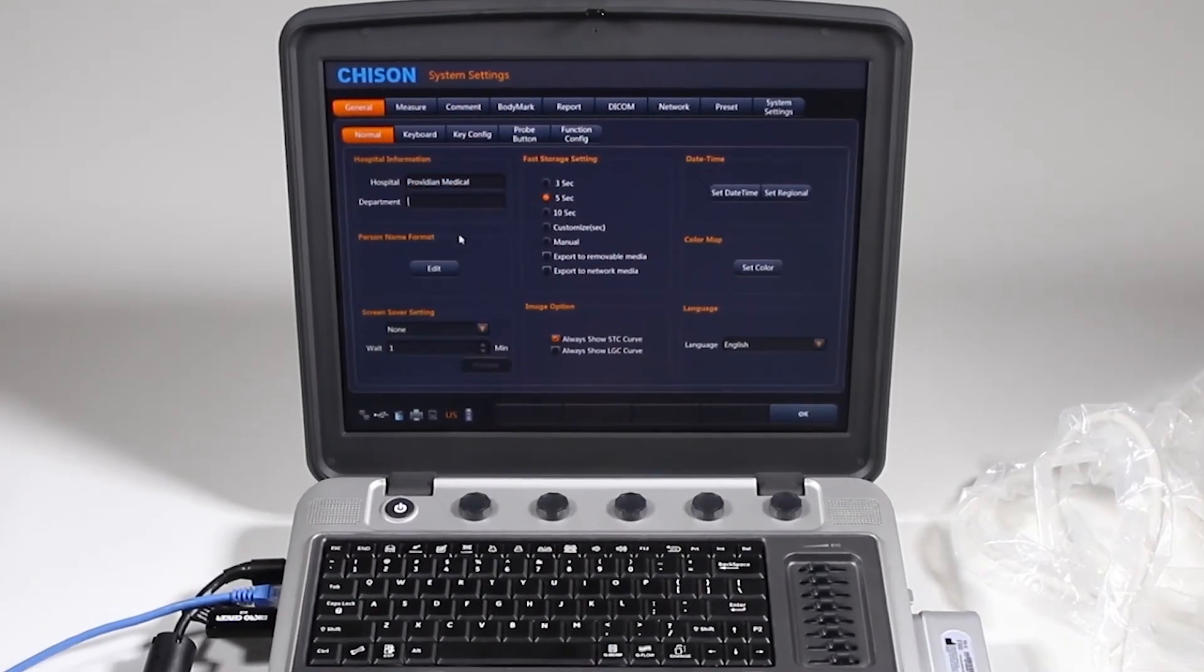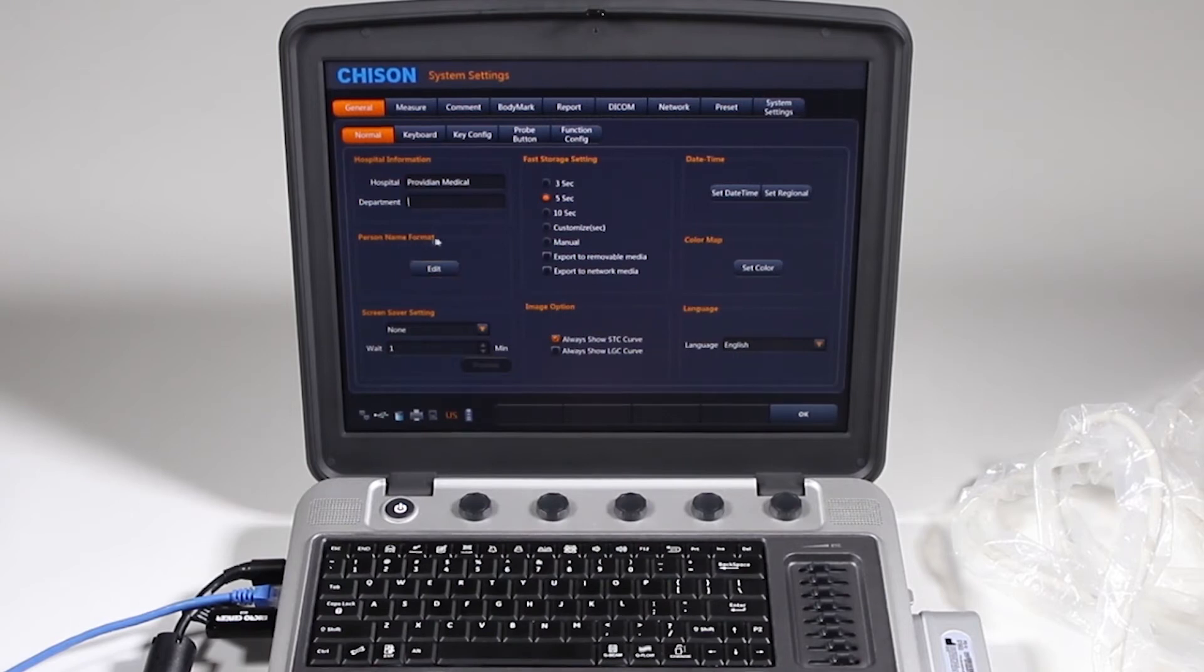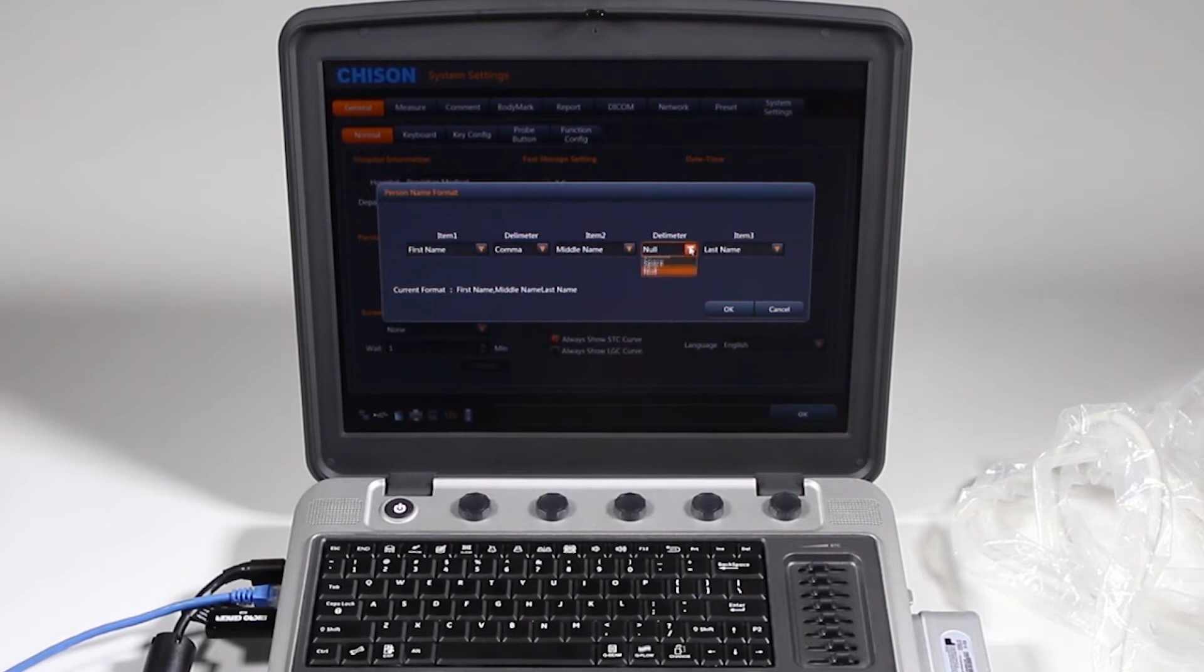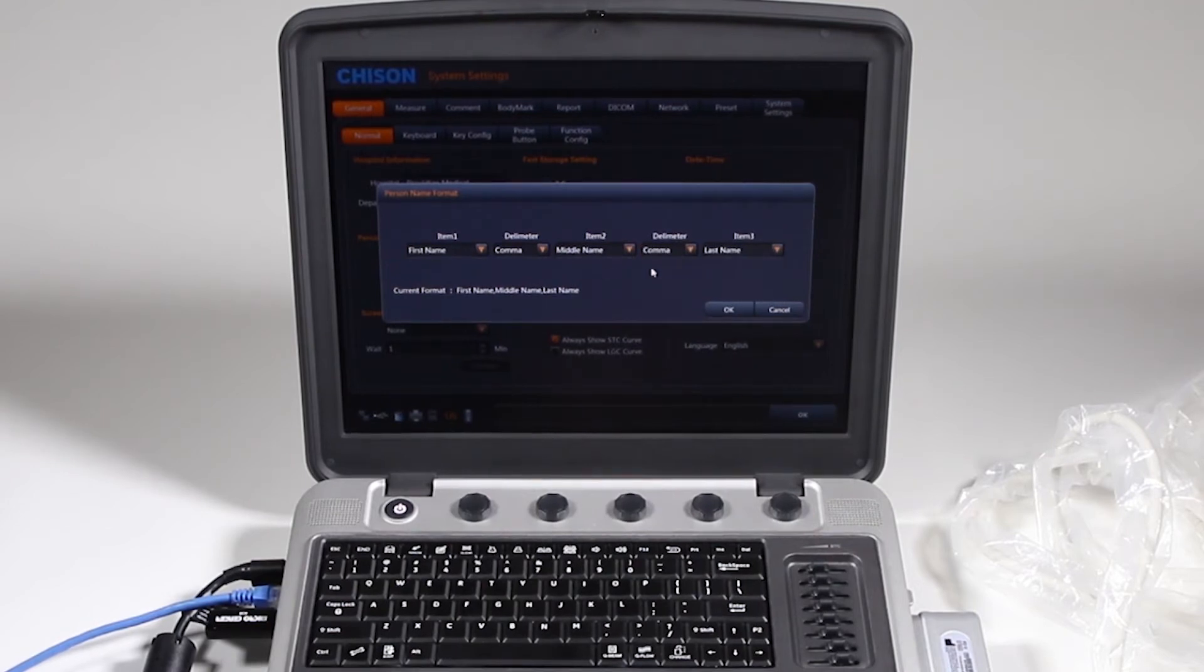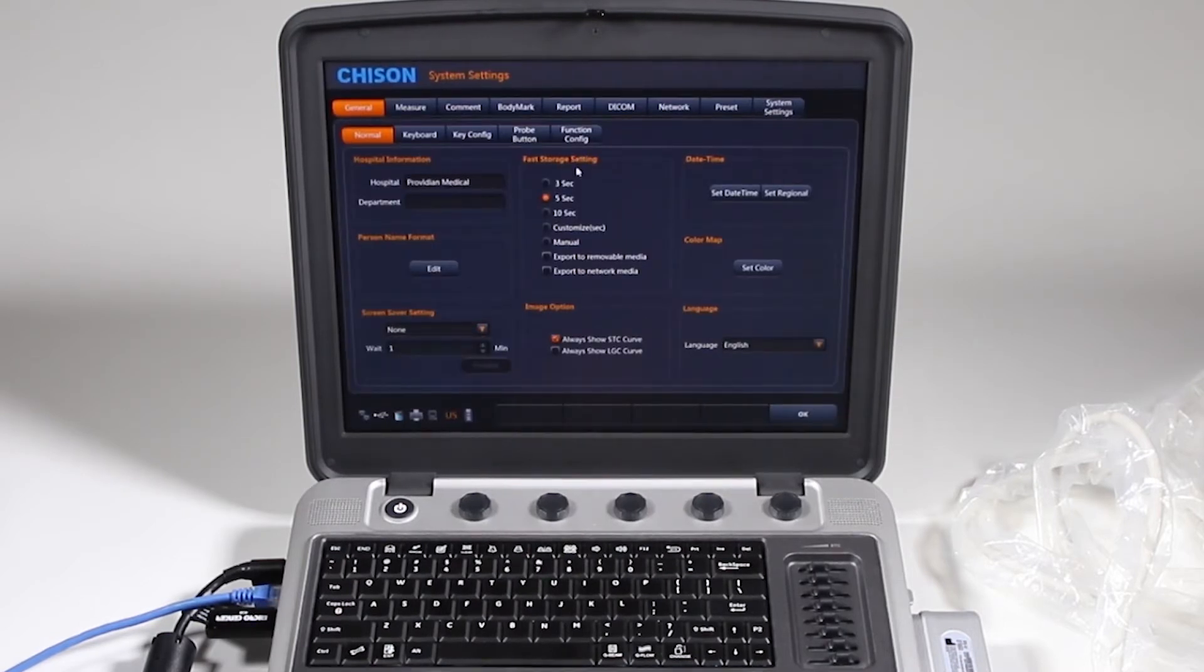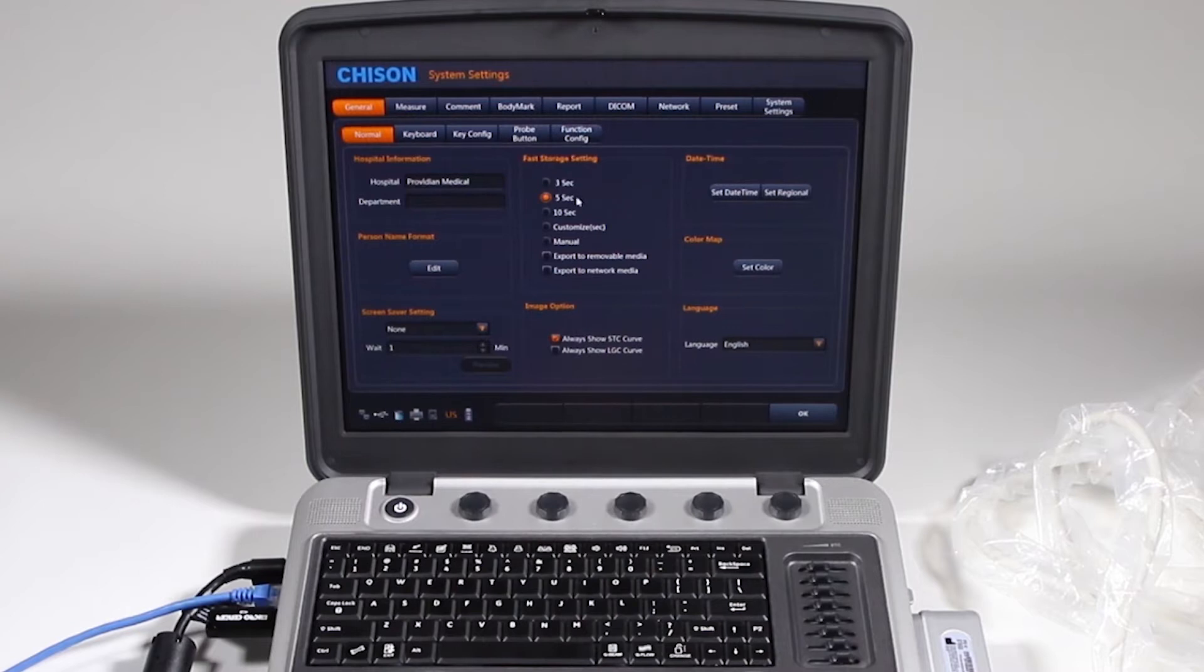You'll want to start on General, and you have your department. You can change the format of how the person's name appears, like you can say comma, spaces in between everything, first name, that kind of stuff, and that's the patient and how they're going to show up on there. Whether you want a screensaver, fast storage setting.